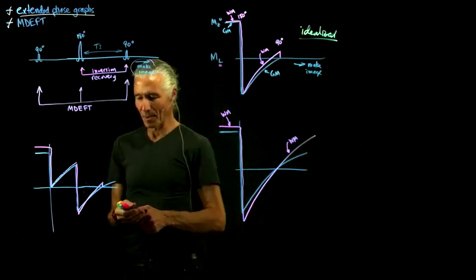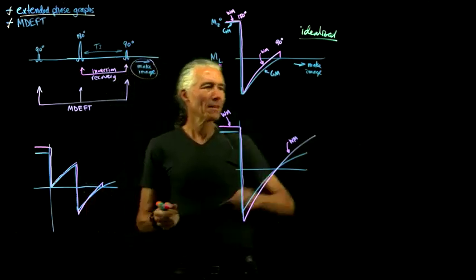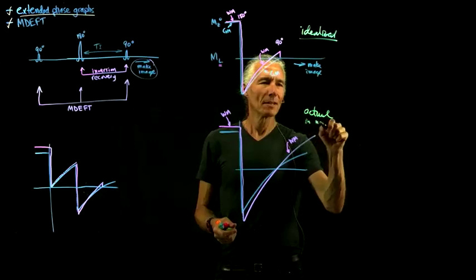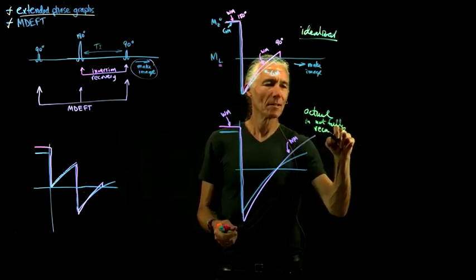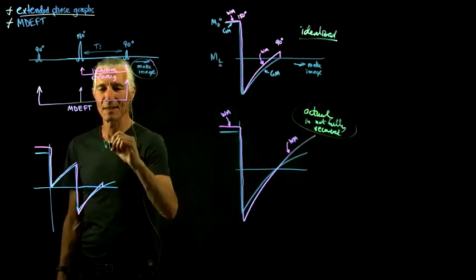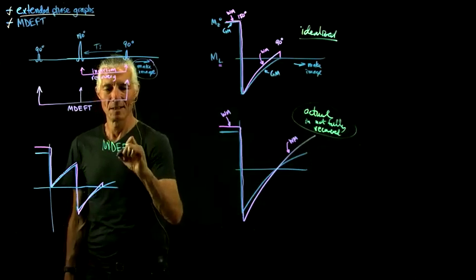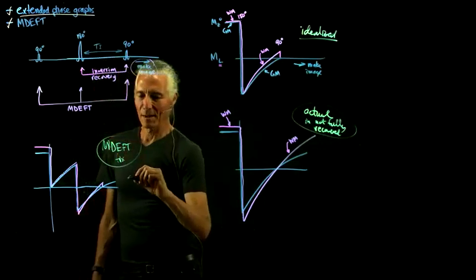So this is like a double. So this is idealized, actual, if not fully recovered, and then MDEFT fixed. Which is basically double preparation.